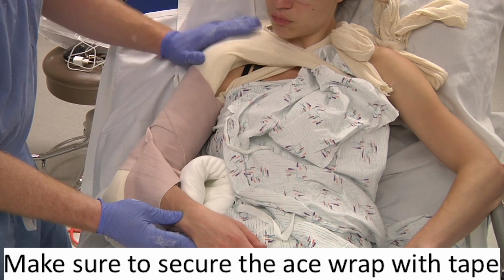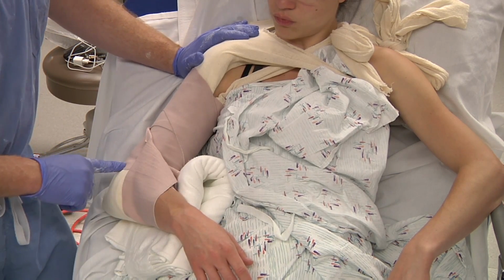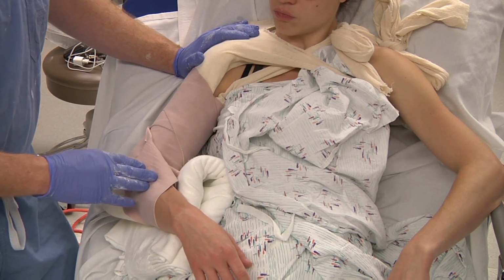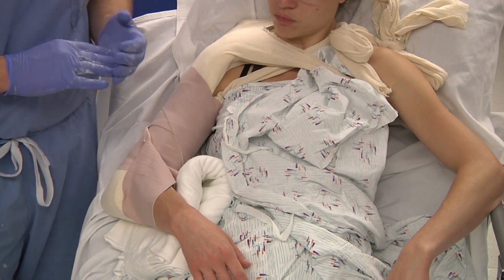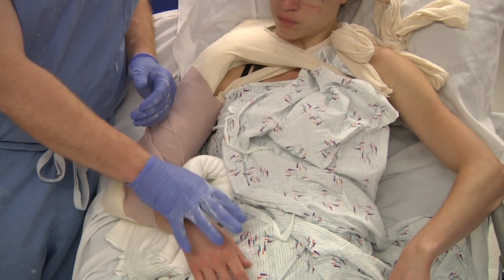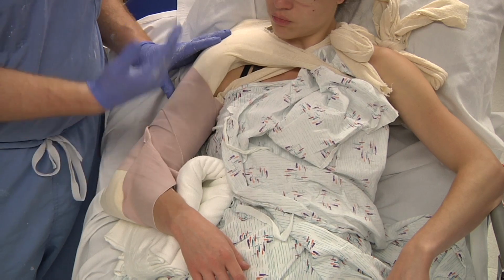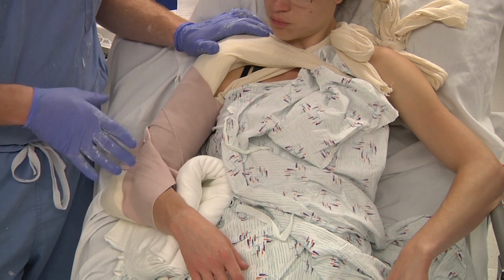One of the main factors to note is that after your splint is applied, it is critical to do a neurovascular exam to reassess any change in neurovascular function, with primary concern about the radial nerve and radial nerve function. As with manipulation of the fracture, it can become entangled or entrapped within the fracture site during your reduction. Let your nurses know that over the next period of time too, if the patient starts complaining of any neurovascular sequelae or symptoms in the hand or up the arm, the physician should be made aware as soon as possible. If there is any change in neurovascular exam, the splint can be removed, and a period of watching should occur, and reapplication of the splint if appropriate.